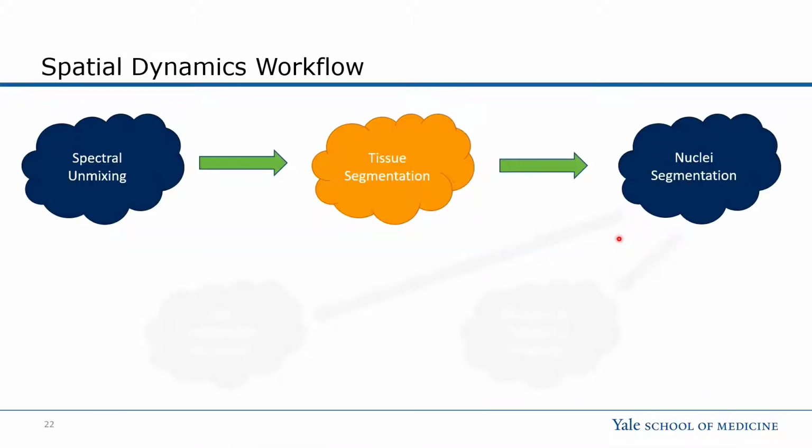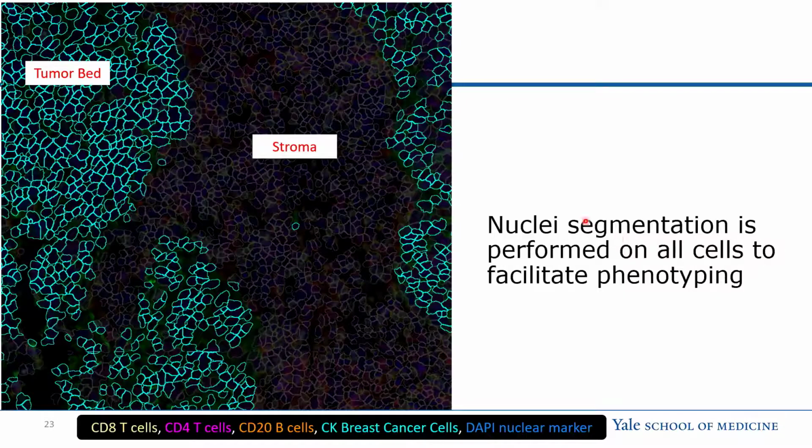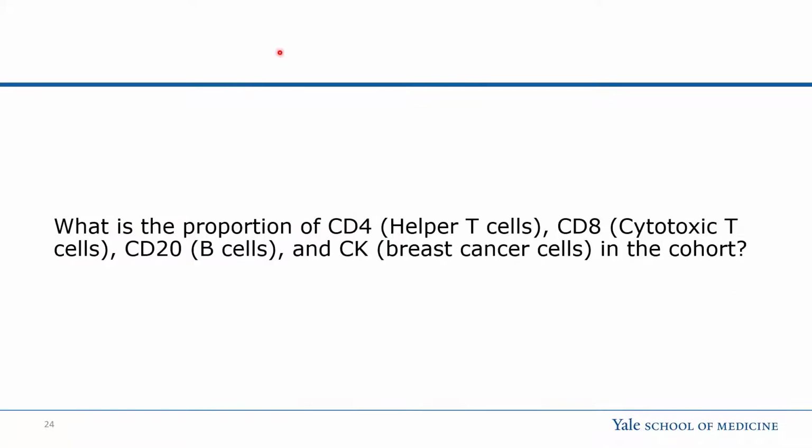And then we do nuclear segmentation, which I will not go into, but again, you saw in the previous figure, quite nicely, the contour mask showing the nucleus of the tumor cells. And then you can see quite nicely in the stroma, the nuclei of the immune cells are also highlighted.